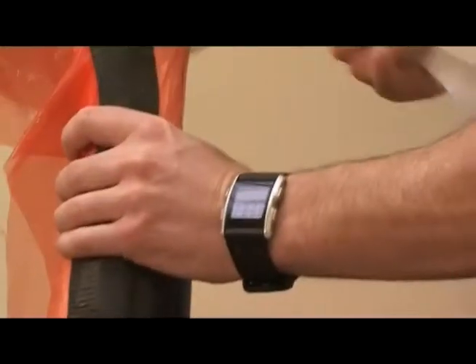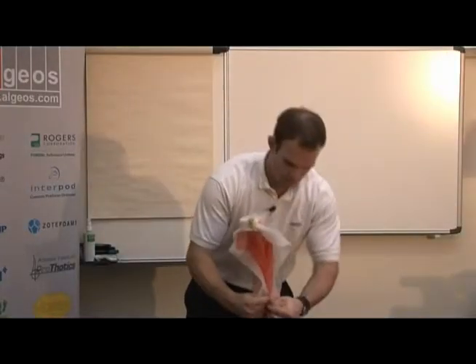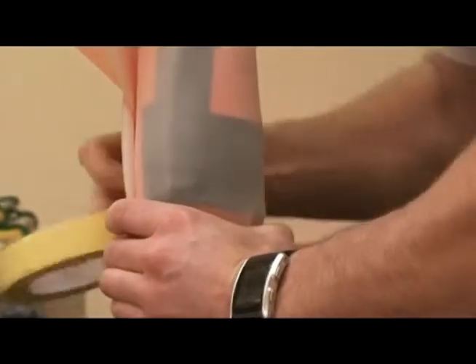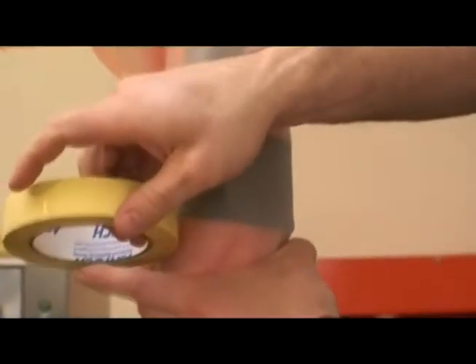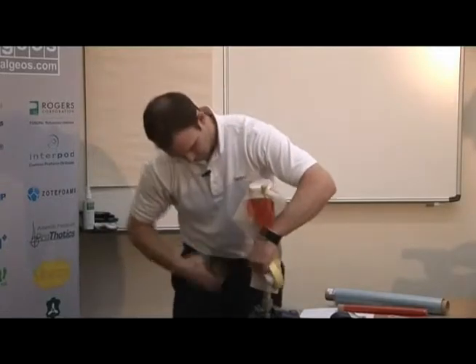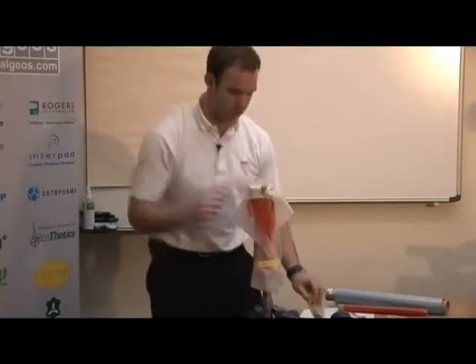Basically what we do is just stretch the silicone over. It's important when you put the silicone on that you really want to make sure you get rid of all the wrinkles.